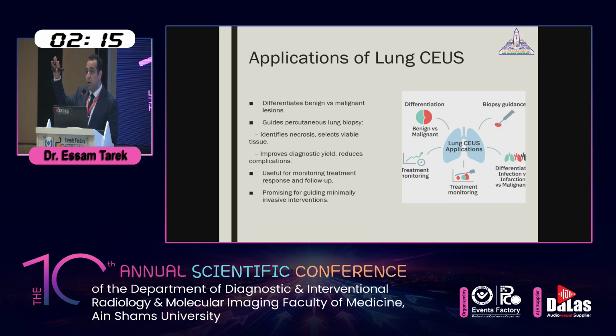The therapeutic or interventional benefit is to ensure 100% that the lesion is viable. Most of the time when we take a biopsy, needle CT-guided or ultrasound-guided, in around 10% to 20% of the cases, the pathology says, okay, you took necrotic tissue. So when we have something like ultrasound that can validate that the lesion is viable and not necrotic, I think it will improve the interventional procedure and increase the accuracy of our biopsy.